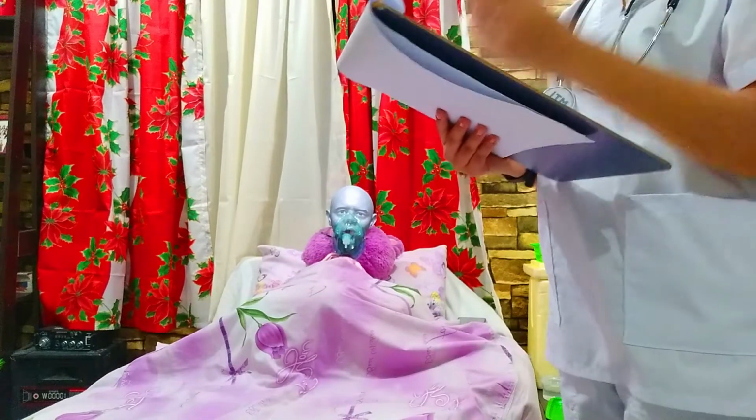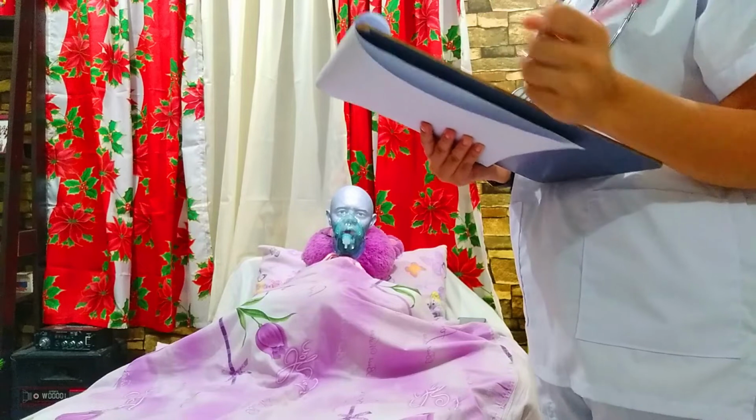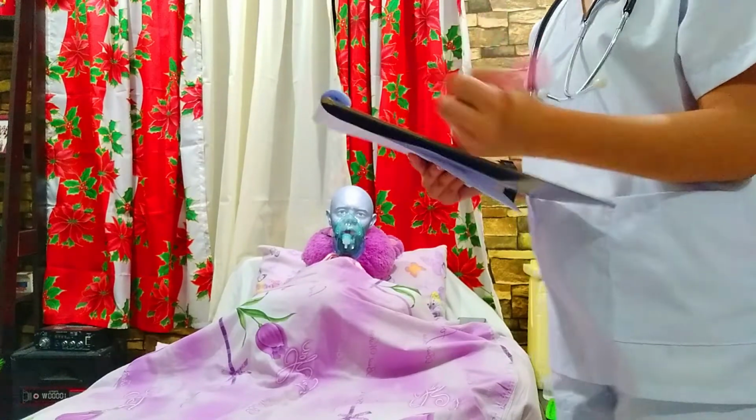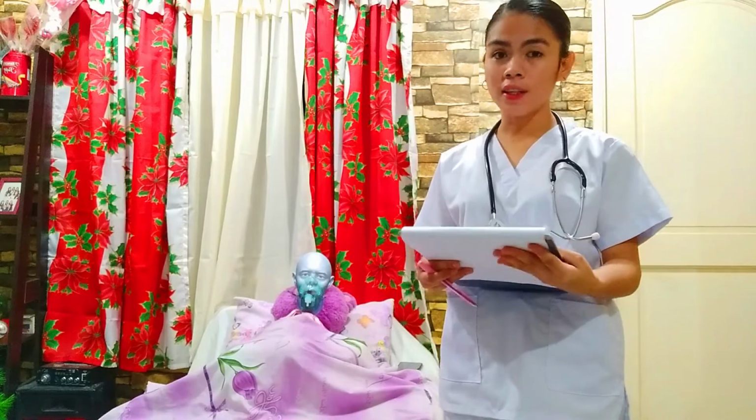And document the procedure and related assessment findings. Also, we need to report any concerns according to agency policy. And that's all for this return demonstration.